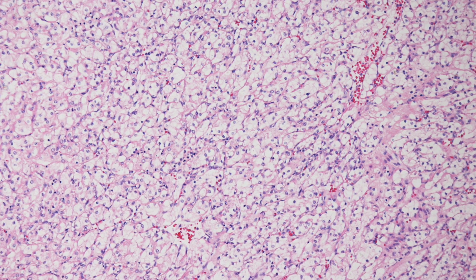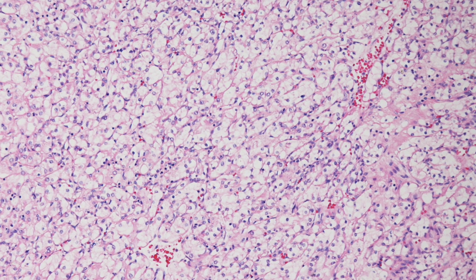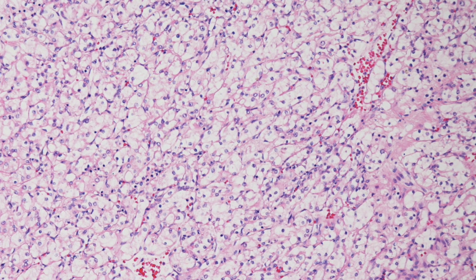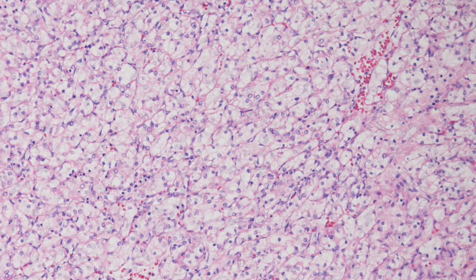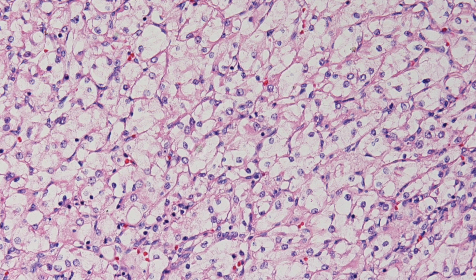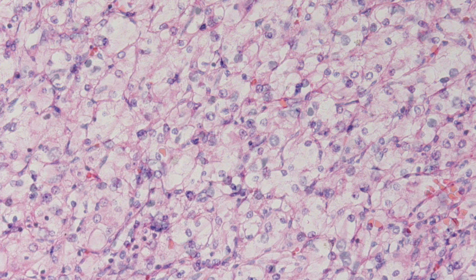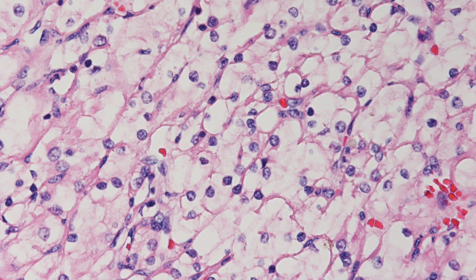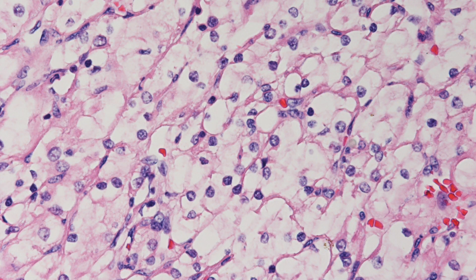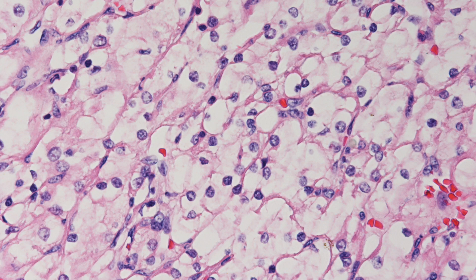On low power you can see sheets of cells with clear cytoplasm and small nuclei. On higher power you can see fairly prominent cell membranes, and at higher power the cells have clear cytoplasm, small nuclei, and inconspicuous nucleoli. So this is a low grade tumour, probably grade 2.